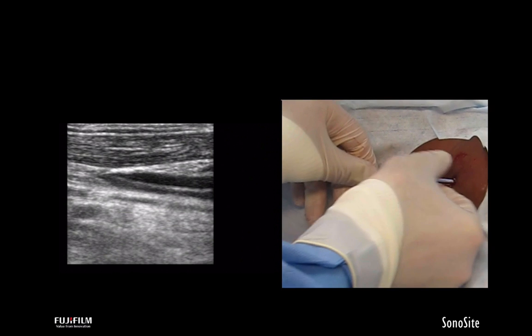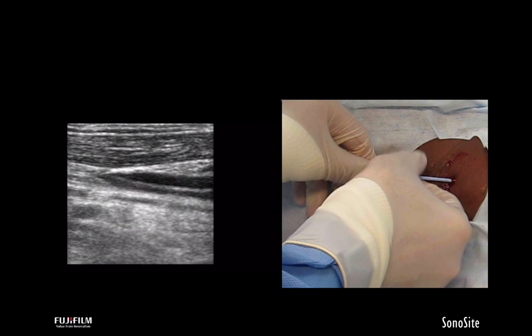If you pull that wire out, it's not a big deal. That wire is nice and thin. You can pull that out and put pressure, not a big deal. But once you dilate, then you really got to be careful about where you're placing this catheter.